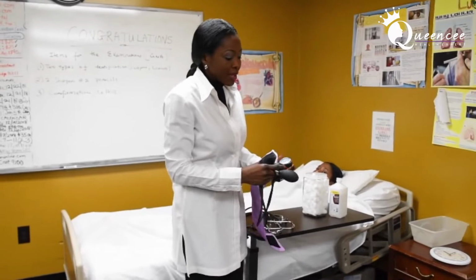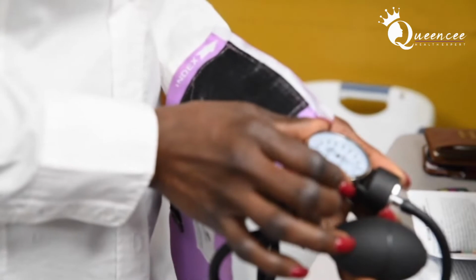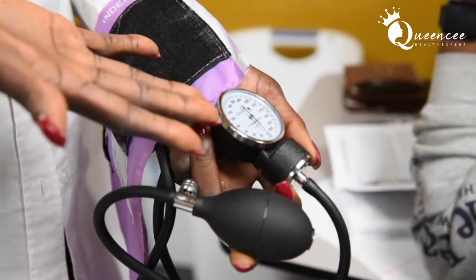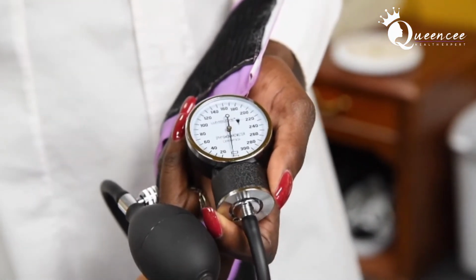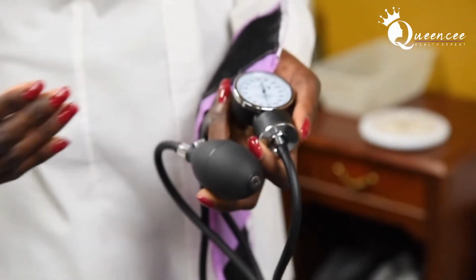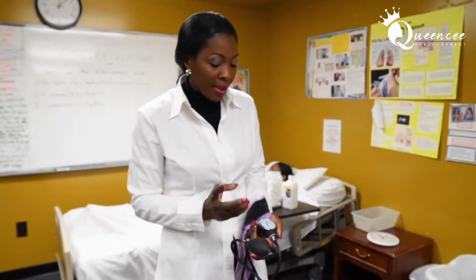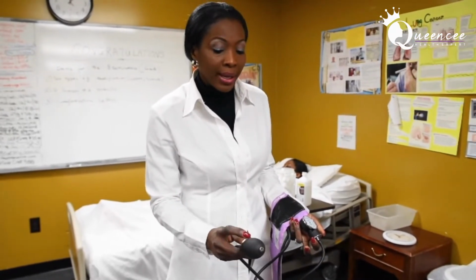You also have this part of the blood pressure cuff. On this area of your cuff, there are numbers here and there are lines here. Each line represents something. Each little tiny line represents 2, whereas on your scale, each little line represents 1. And then you would have a dark line that represents a 10. And then we have the bulb here, and you have this dial here as well.